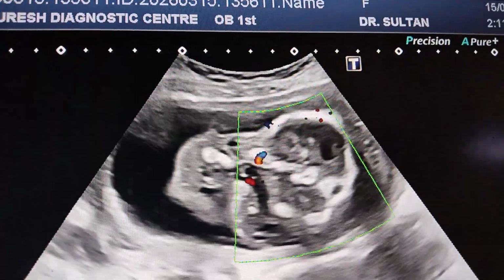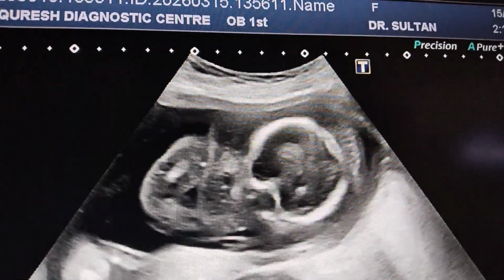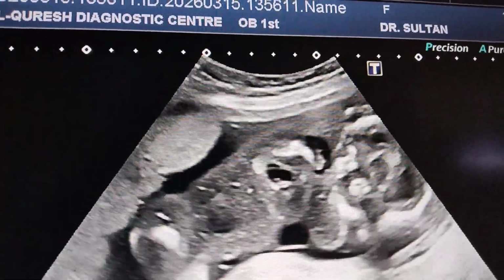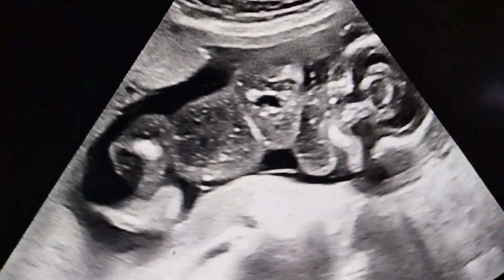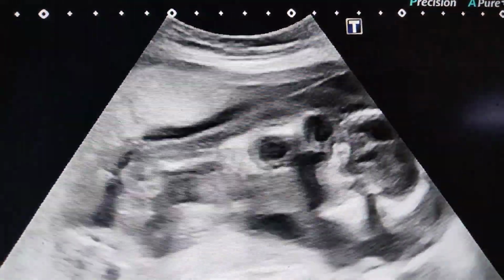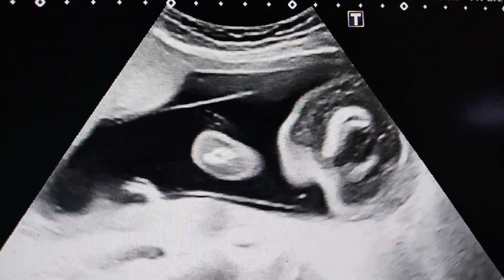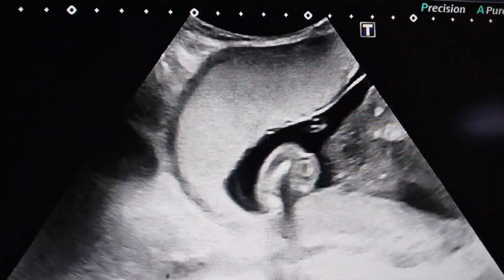I have seen the middle cerebral artery that is within the normal range in this fetus. And when we come across hydrops fetalis, we should also see the amniotic fluid. Here the amniotic fluid is a little bit increased, and also we see the placental thickness.